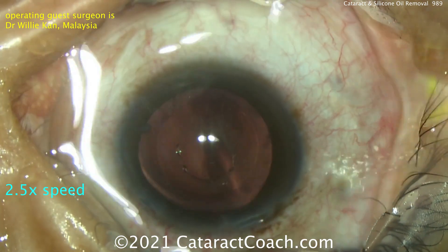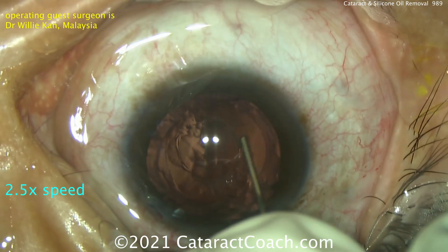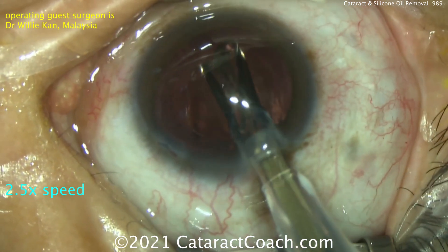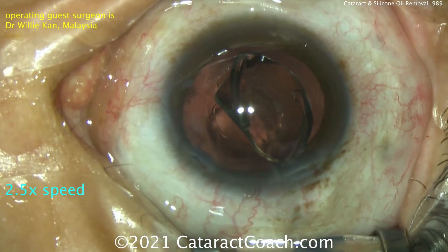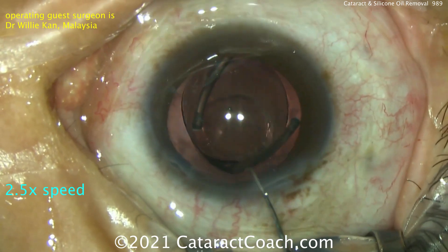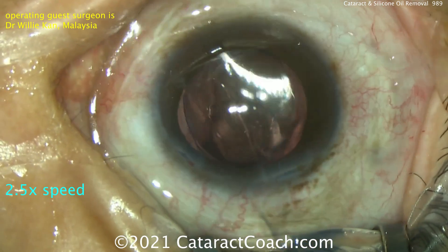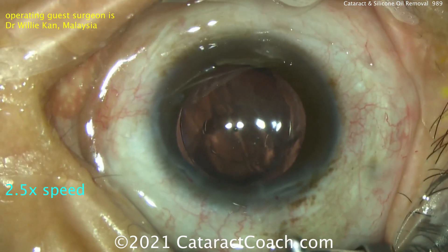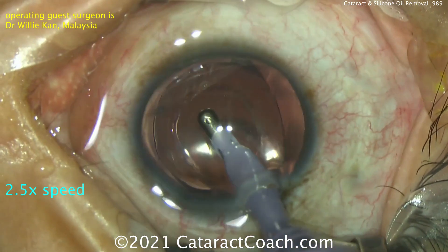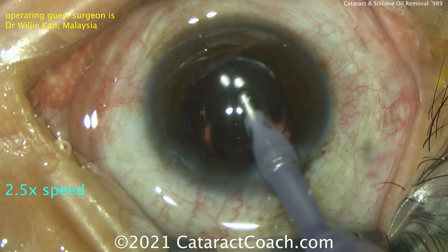Sometimes it's hard to remove absolutely 100% of the oil droplets — you may only remove 99-plus percent. So I'd encourage you to put in an acrylic lens, which is a very good choice here. In terms of lens calculations, since you're removing the silicon oil, that's not going to play much of a role, so you can do your calculations in a routine way. However, if you were going to leave silicon oil in the eye, you'd have to account for the difference in optical power by adding quite a few diopters — probably about four or more — to the lens power.